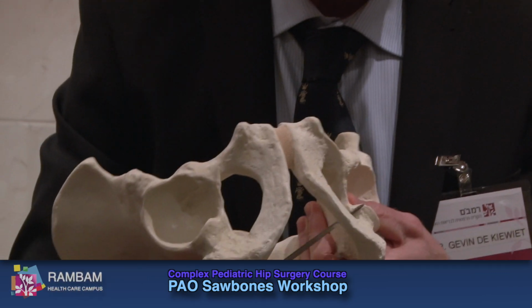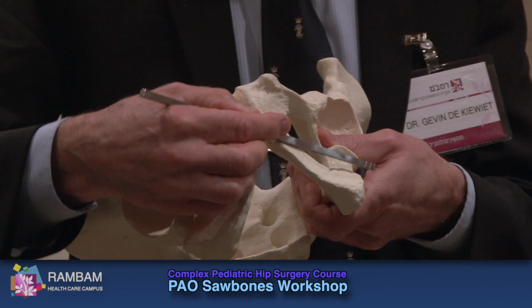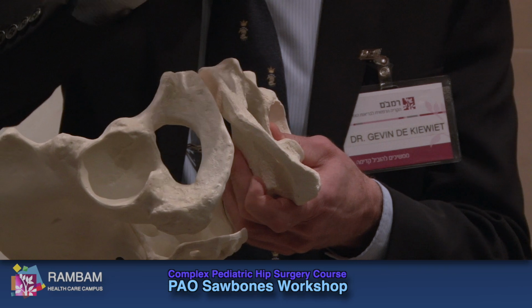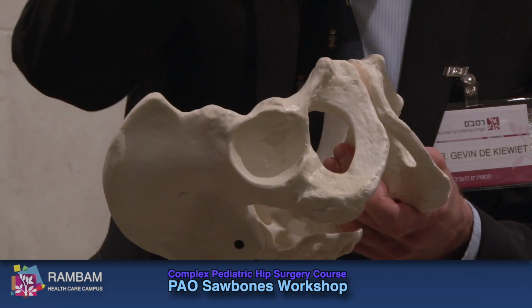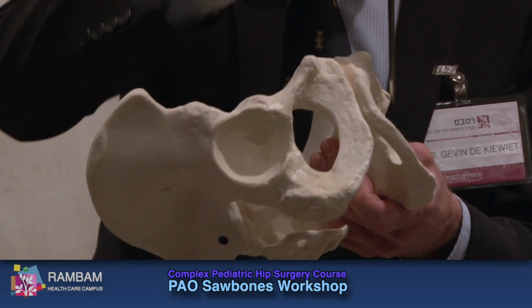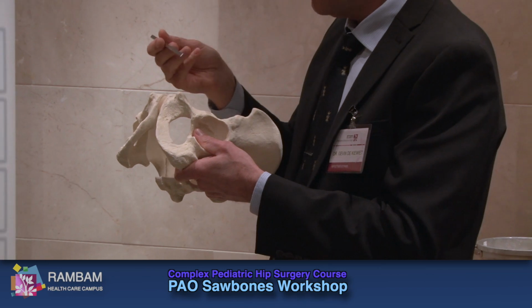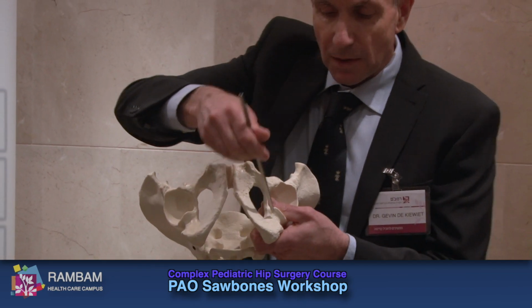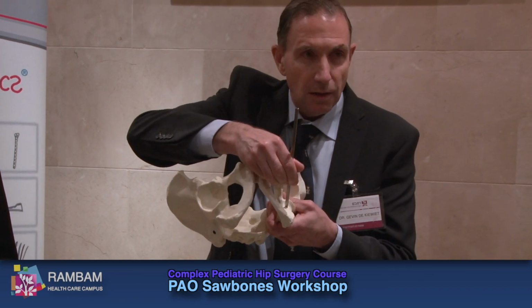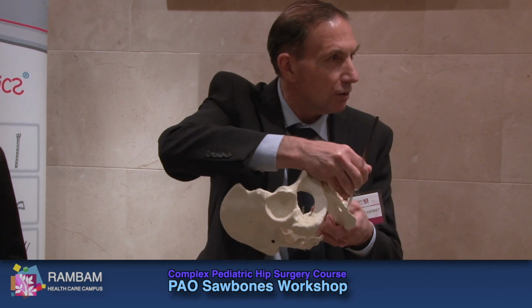Remember, obturator internus is coming along here. Transverse fibers are doing that. So you can open that up with your scissors. The capsule's here. You're on the capsule. Stay on the capsule. Go down. Iliopsoas is coming here. Go down. Hit the ischium. If you look down there, you'll see some transverse fibers. That's going to be your obturator internus going across there. You want to be just above that. You want to go onto the bone and feel it coming up. You can feel this. It goes up. As you put your osteotome like this, you feel the inferior cotyloid notch.